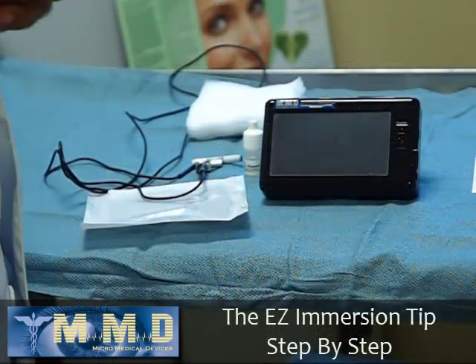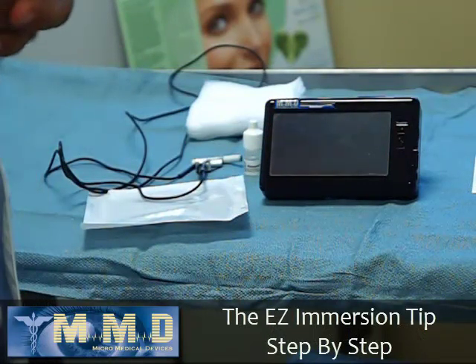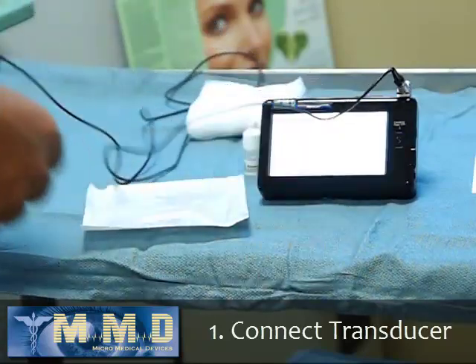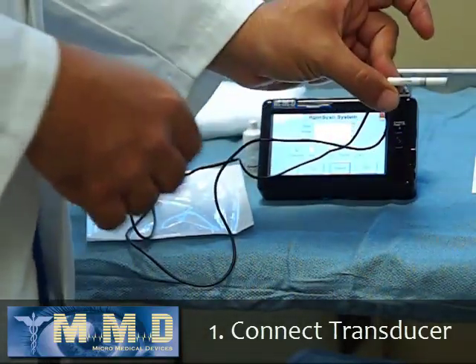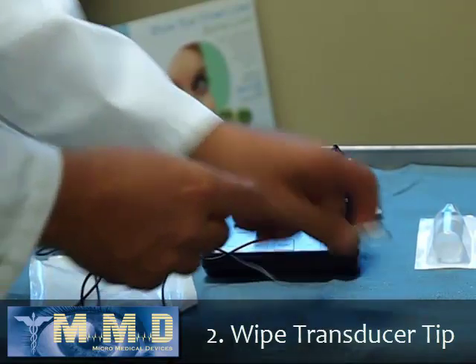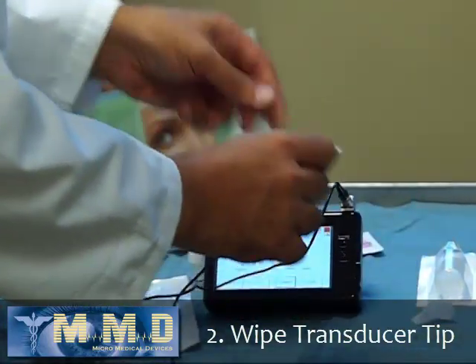I'd like to go step by step and talk about exactly how I use the Easy Immersion Tip with great success. The first thing you want to do is connect the transducer to the machine and make sure the PalmScan turns on. The transducer tip should be wiped with the alcohol swab — even though it doesn't really come in contact with patients, I still wipe it and then dry it.